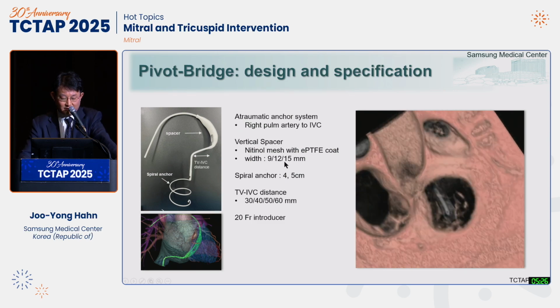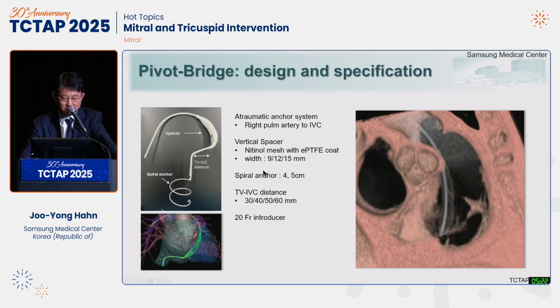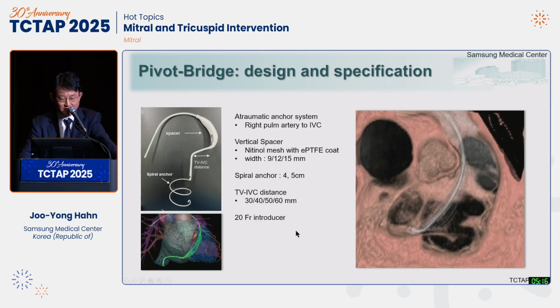It is made of nitinol mesh with EPTFE coat. Its width ranges from 9 to 15 millimeter, and it needs a 20 French introducer.